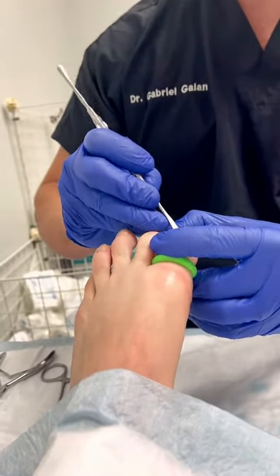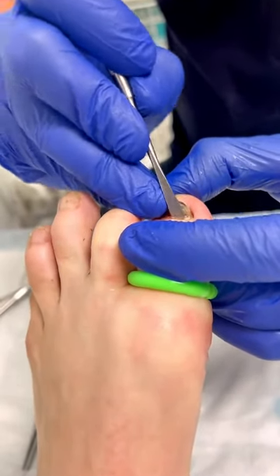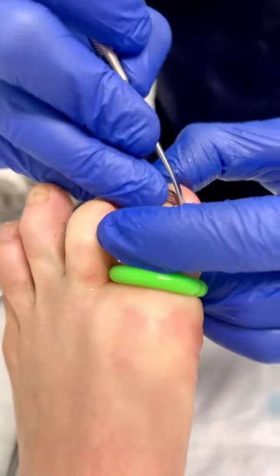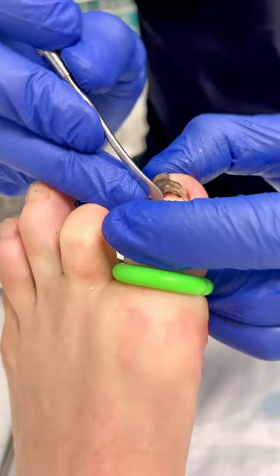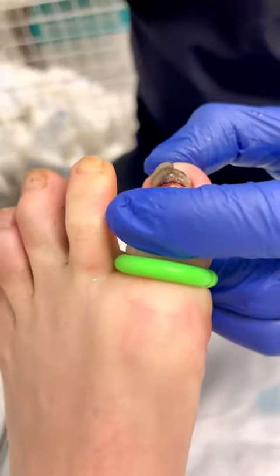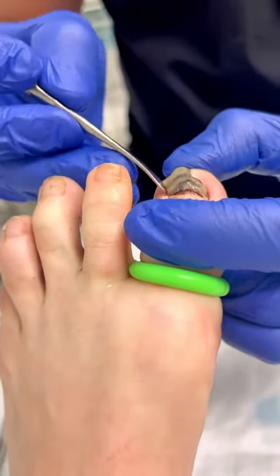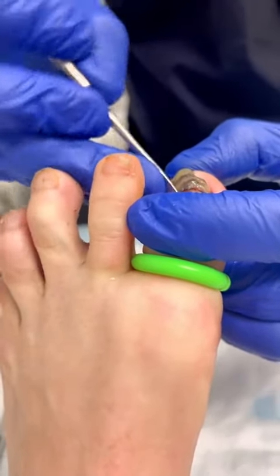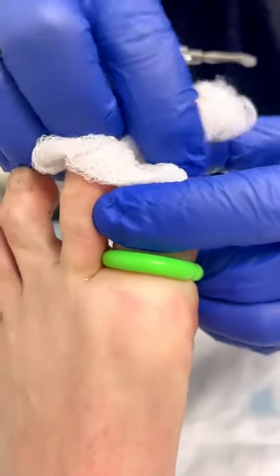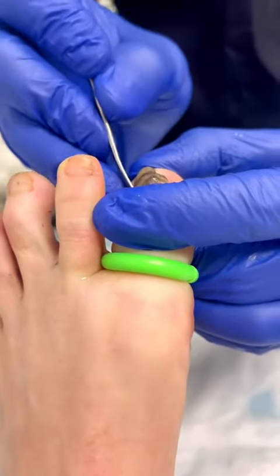The first thing we do is loosen everything up on the sides, going around and loosening everything. Do you feel any of this? No. So as we loosen the whole nail, you can start feeling that give that tells you the nail's ready. We go around the top first, then down the sides.